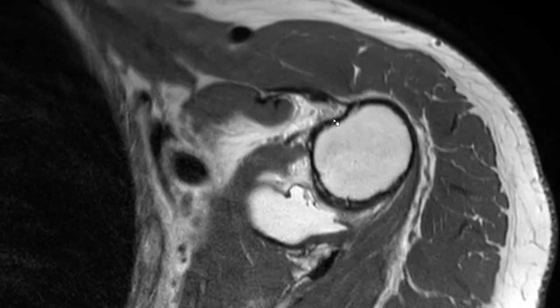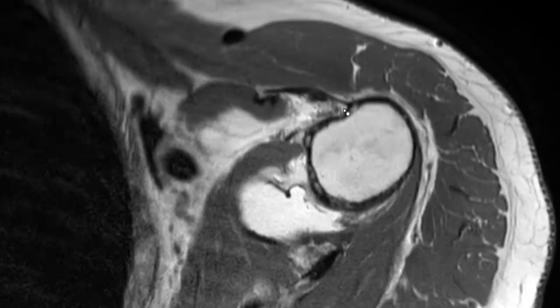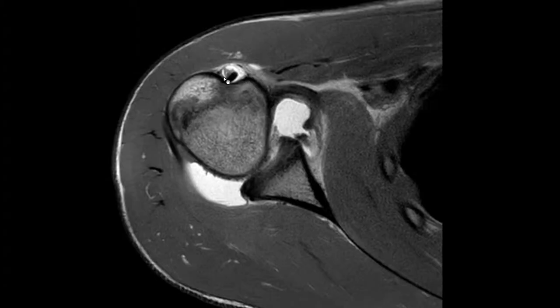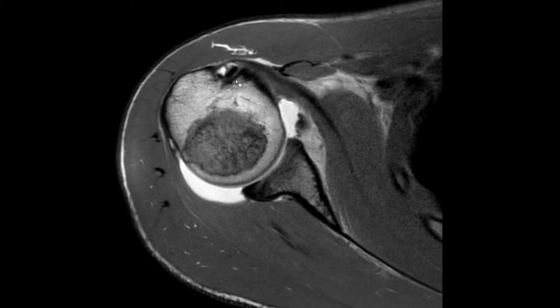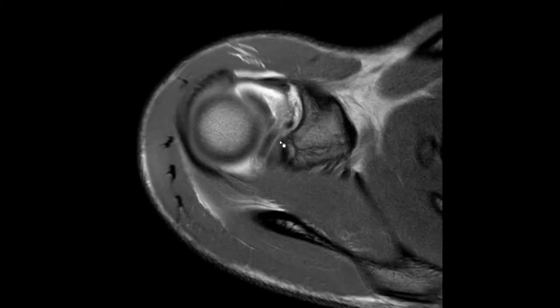A point I'd like to make is this structure here. You frequently see some black linear structure laterally to the long head of the biceps tendon, and that should also not be mistaken as an accessory head. Again, we have the long head of the biceps tendon here, inserting into the glenoid.